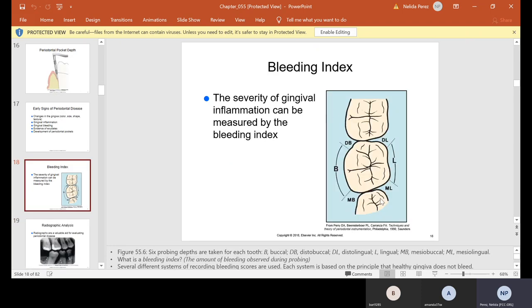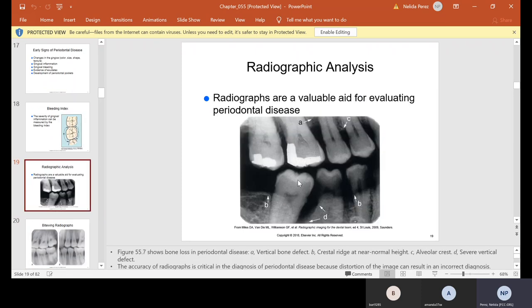Bleeding index: here is a perfect example of what they measure with the periodontal probe. They go to the distal, buccal, and mesial on the buccal side, then to the distal, lingual, and mesial lingual on the lingual side — that's your six probes the doctor takes. If it's not the doctor, it will be the hygienist. They are checking to see how severe the inflammation of the gingiva is, measured again with a periodontal probe.